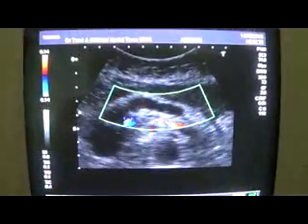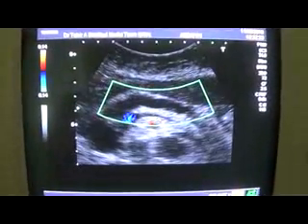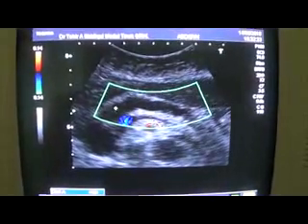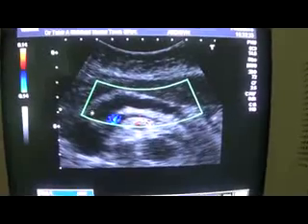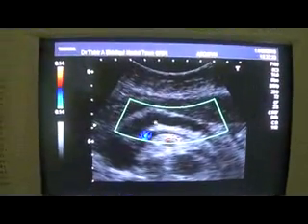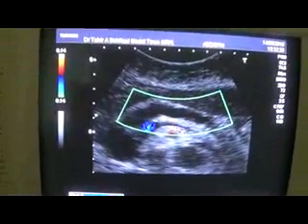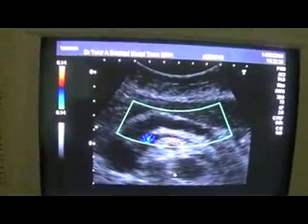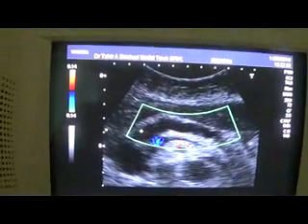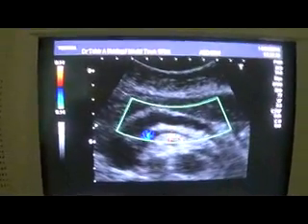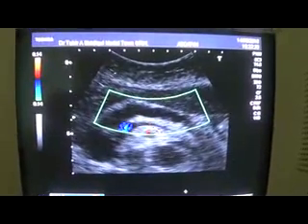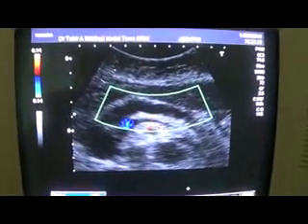Now the ductal portion — this is the pancreas and this is the tubular structure representing the duct. It does not have any blood flow within it on Doppler, confirming it is the pancreatic duct. Here is the mass, and this is the superior mesenteric artery. This is our case of the day. Thank you very much.